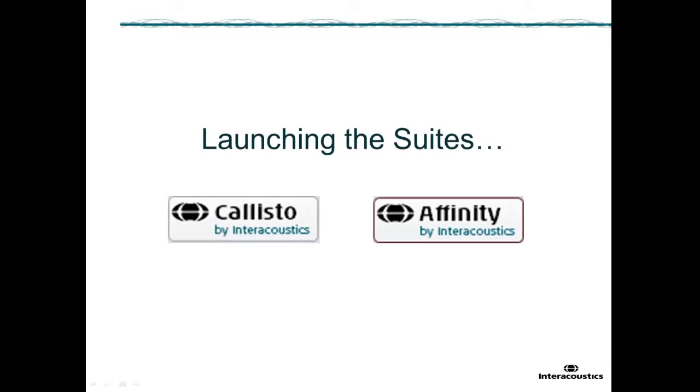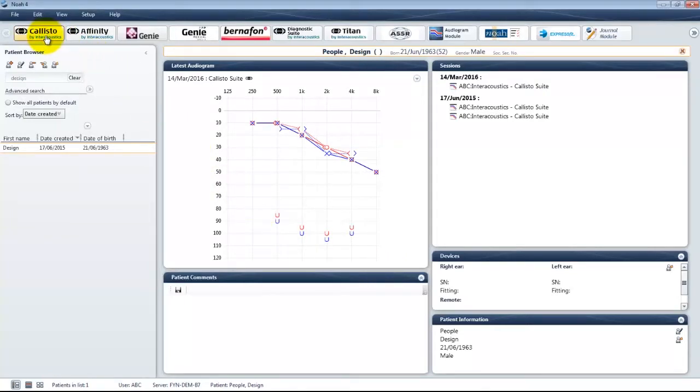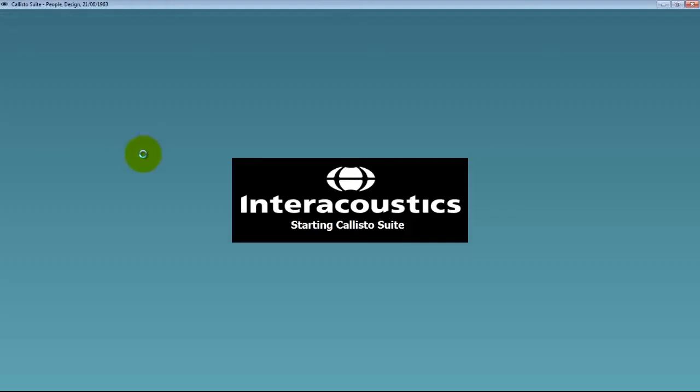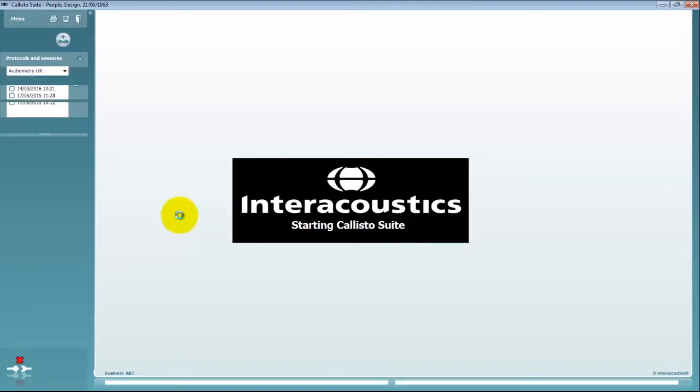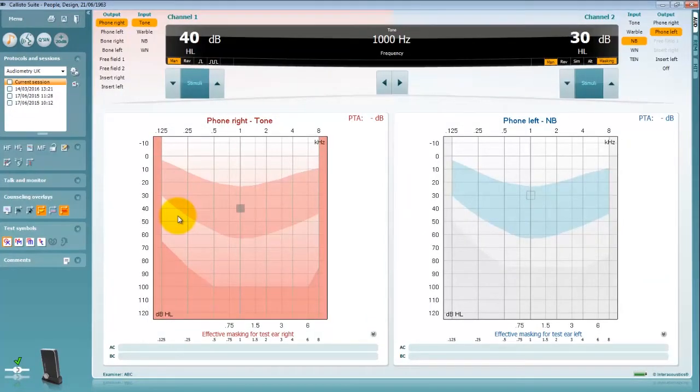In this example the suite has been opened via a direct link from a Noah database, however it may be that you're required to open the suite from your proprietary patient management system. Please check on how to open this with your IT administrator.